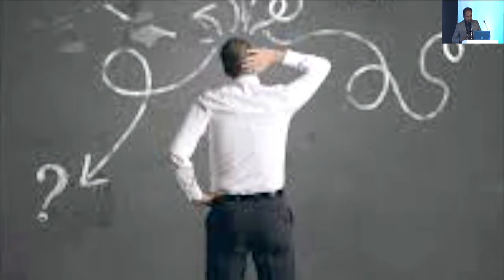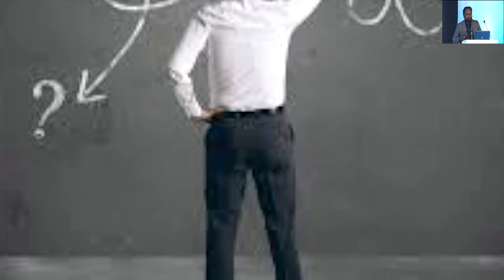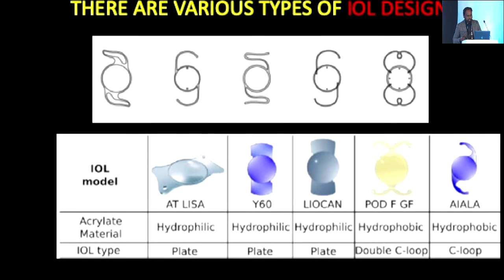So first, when Deepak sir gave me this topic, I was also wondering why. I usually say the question why will give you the answers. Even for your surgical mistakes in videos, unless you record it, you keep playing them back again, and you keep analyzing in your mind why. Unless you know the question why, you will come up with a series of explanations of what could have gone wrong and what you could have done to avoid it.